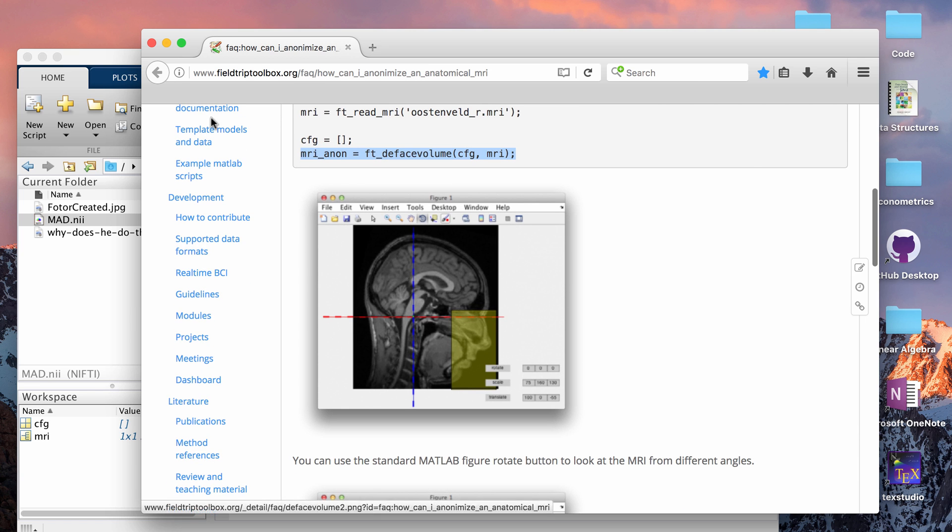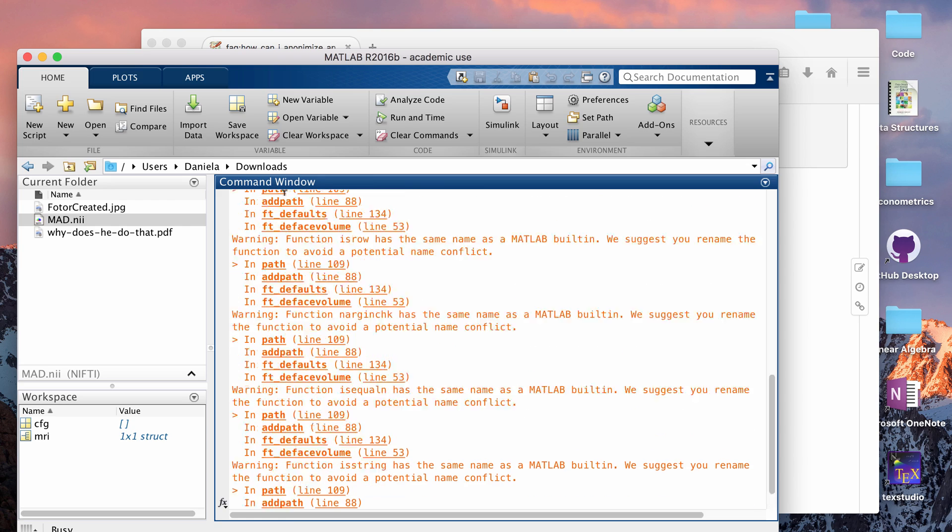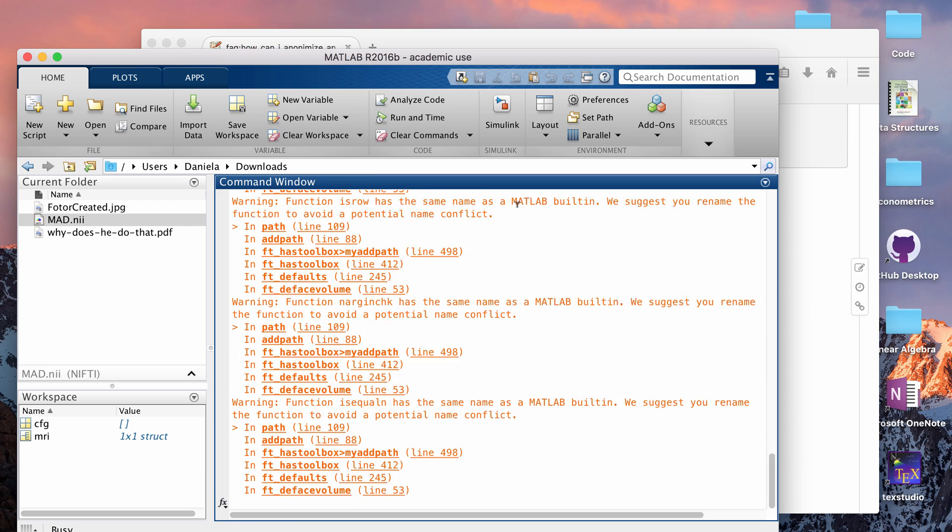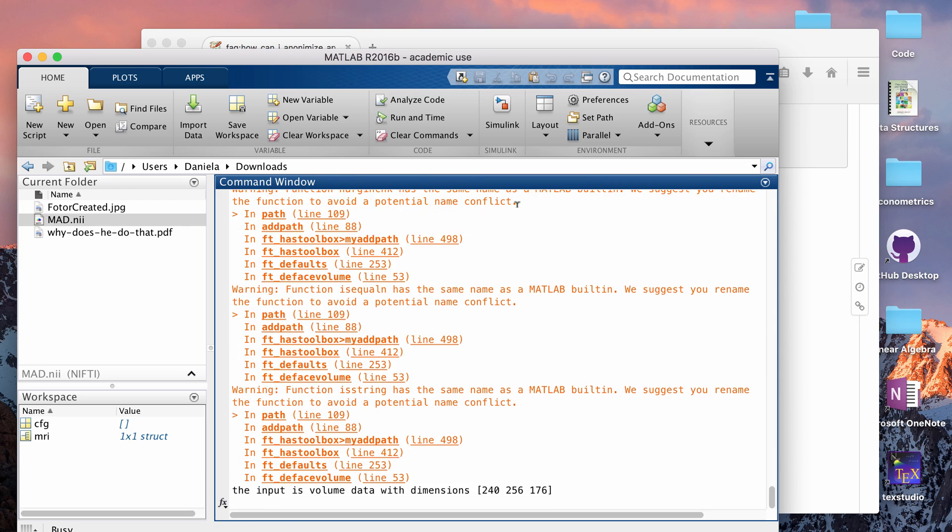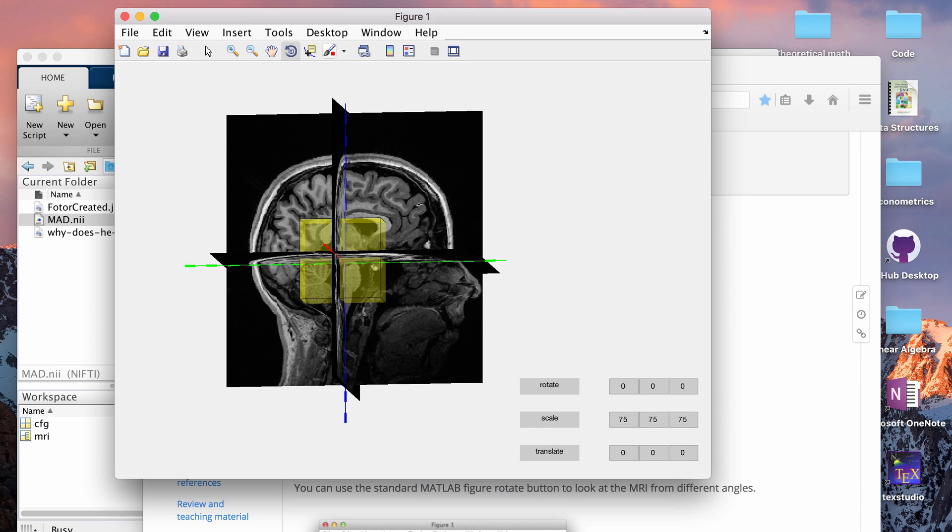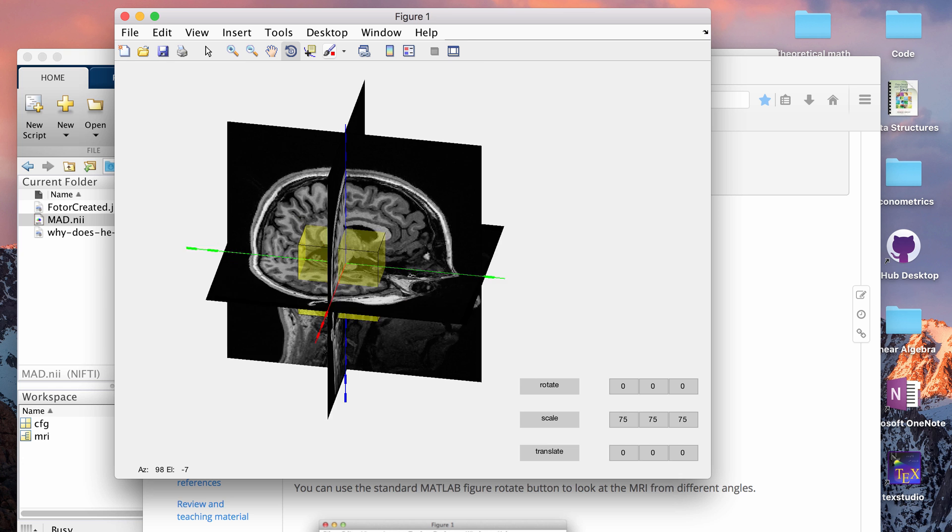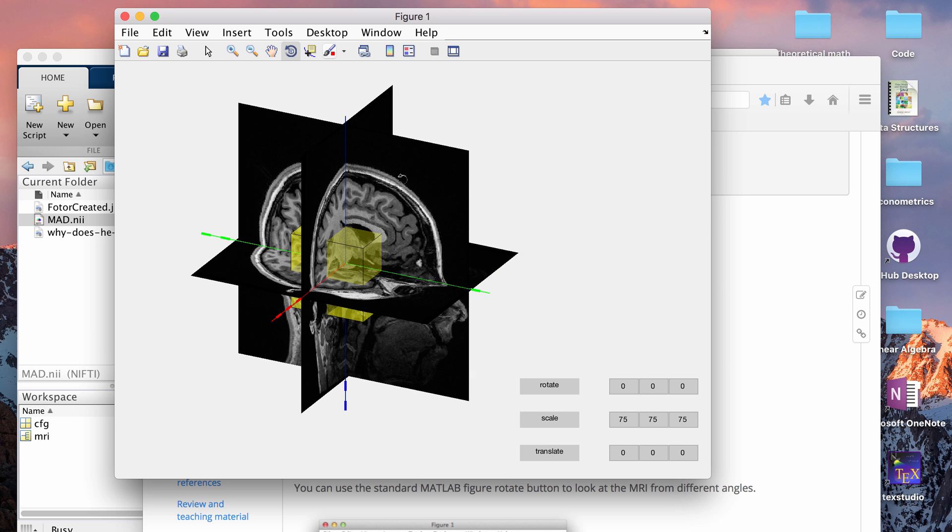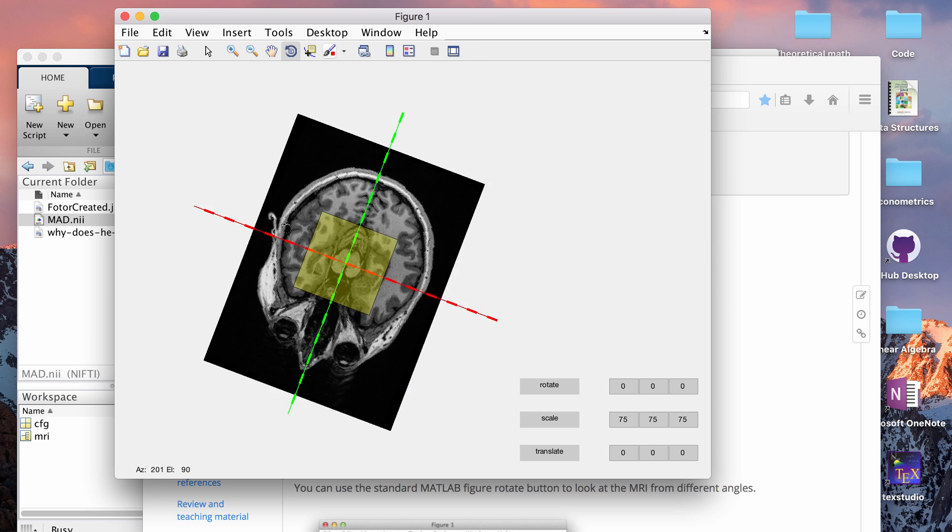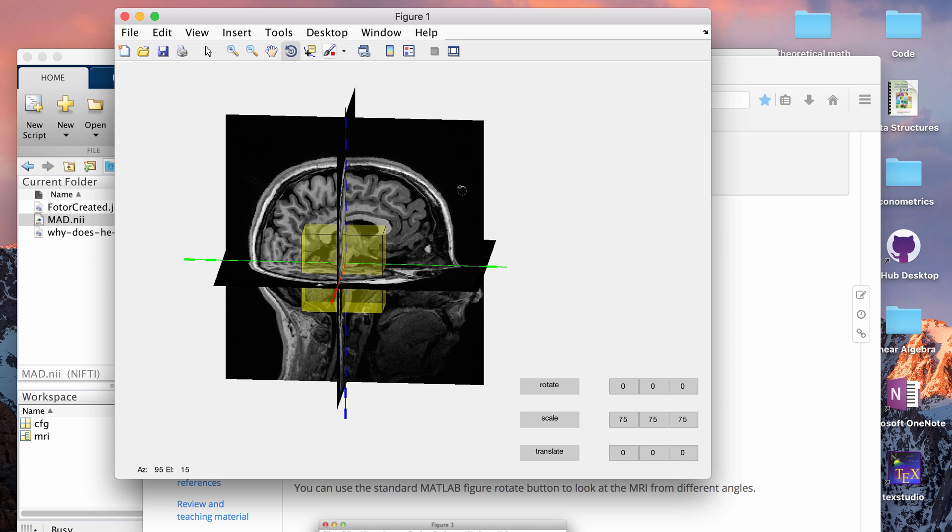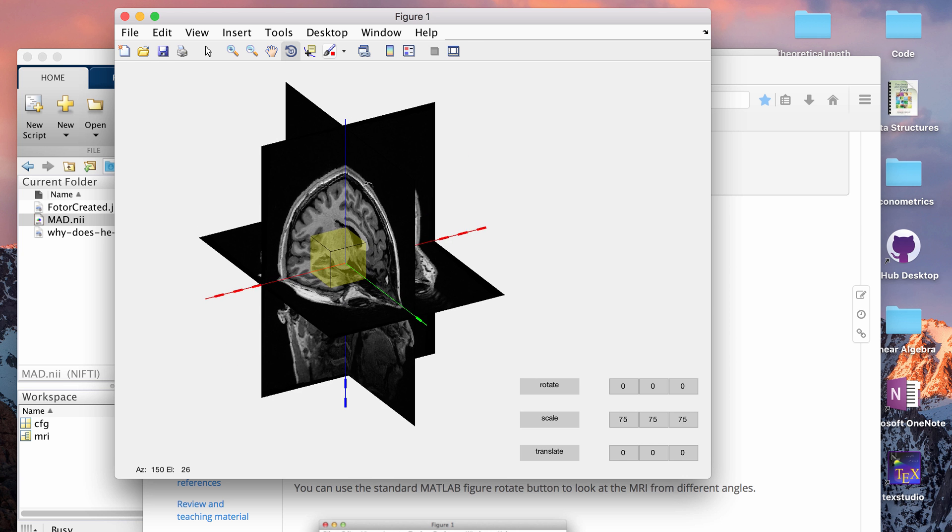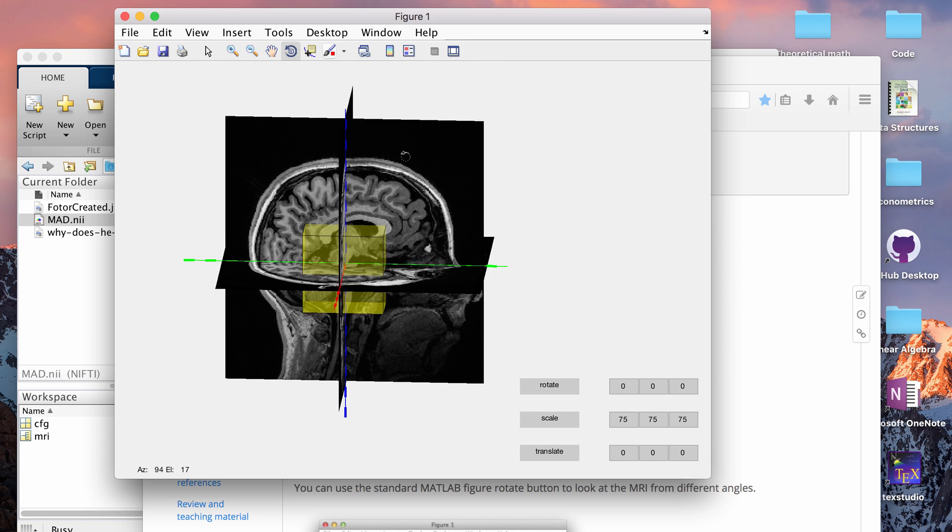So that's going to open a figure box and the figure box is going to let you manually create your defaced MRI. So I like using the FieldTrip method of deface because you can do everything manually. This yellow box is what's going to be removed from the image and it's showing you a three-dimensional view of what the image looks like. So you click this little button and then you can rotate to see from any angle that you want.